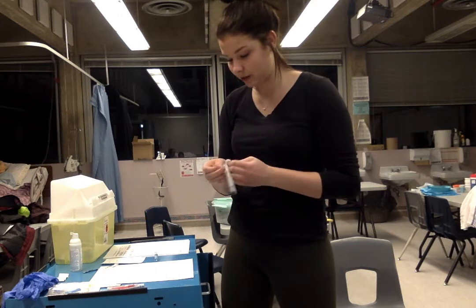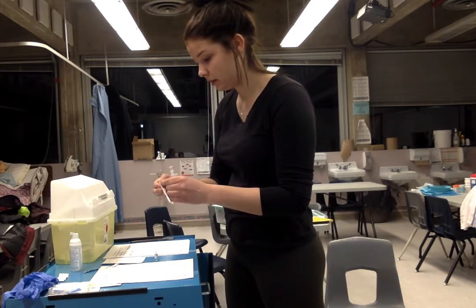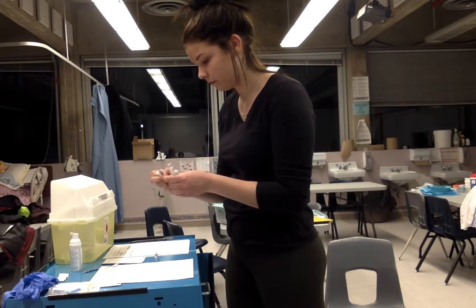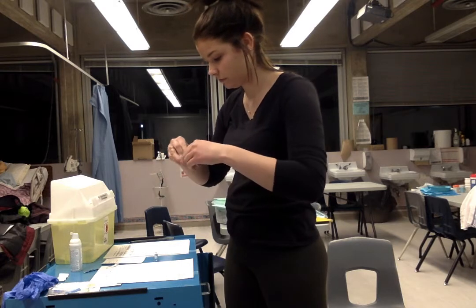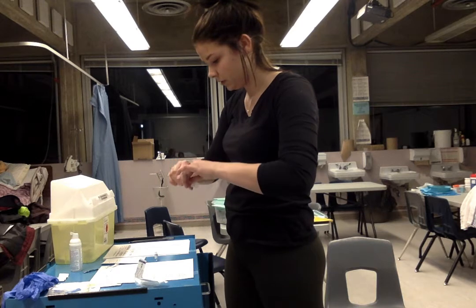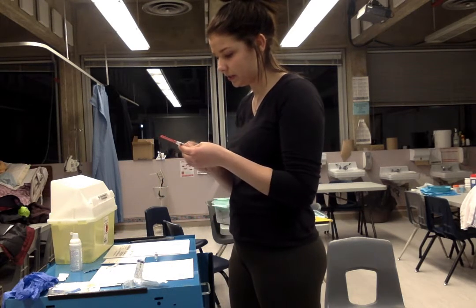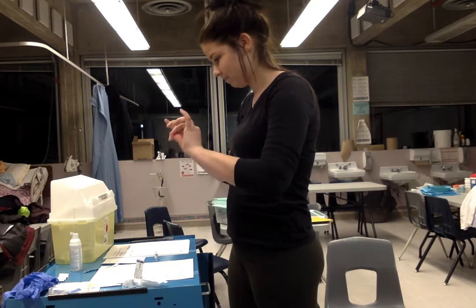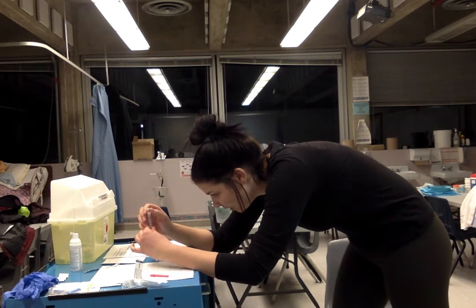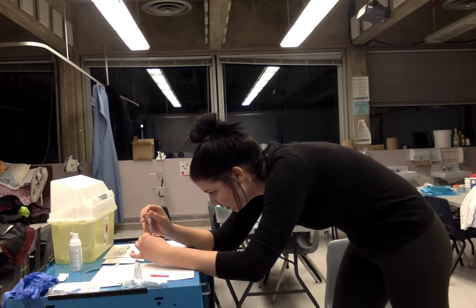So now I'm going to take my 3 ml syringe as well as my blunt filtered tip because we are using an ampule. Screw that on. Just work this a little bit so it's easier. Remove. And I'm just going to draw up the full 1 ml, and then I will waste the rest after.